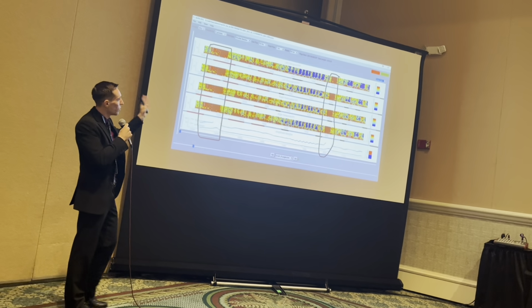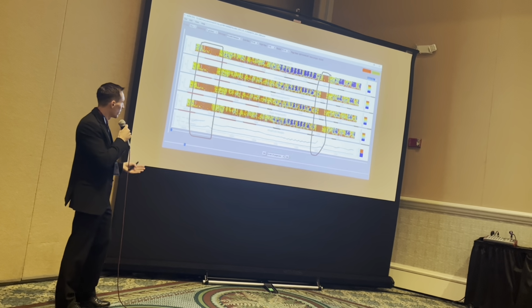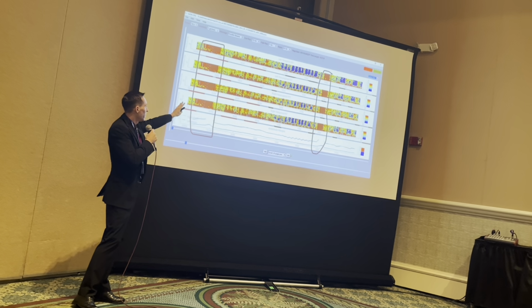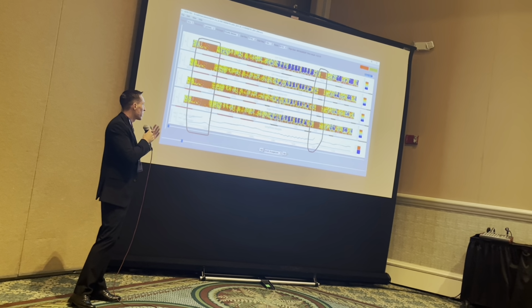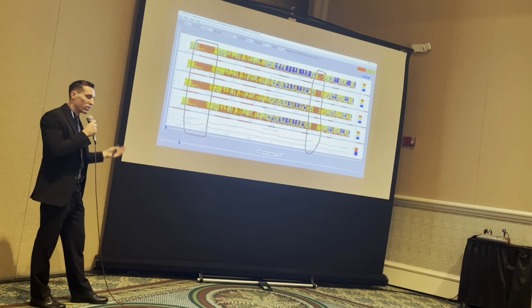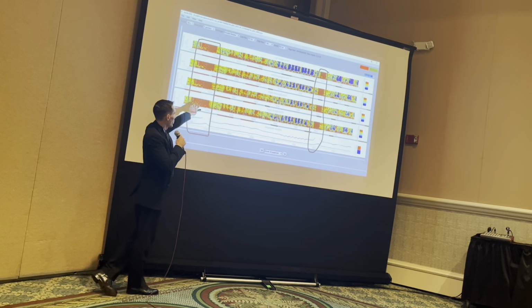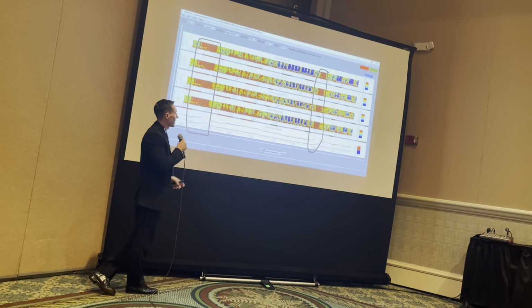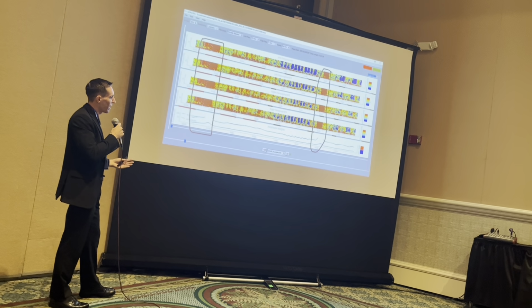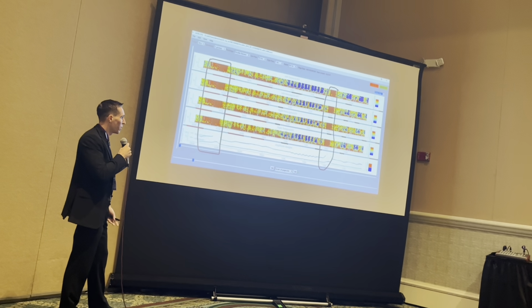Upon looking at the raw EEG data, the squiggly lines, we did more investigating, and we found that these things that look like flames weren't epileptic seizures, they were psychogenic non-epileptic seizures. So these essentially just represent artifact. The patient was moving around, having their event, no epileptic activity, but it is a kind of seizure, psychogenic non-epileptic seizure.